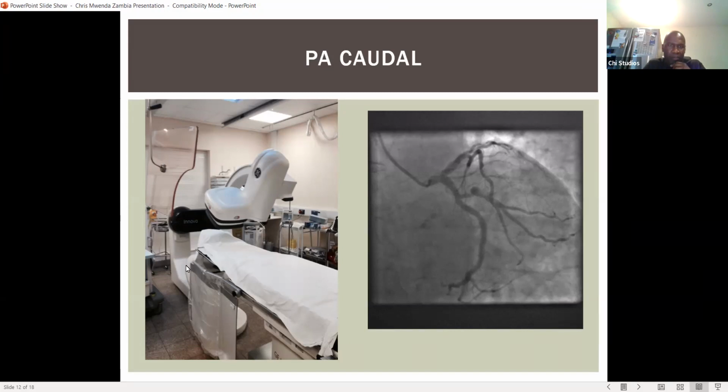Because this is a skirt, which was part of our radiation protection to protect the consultant. Usually the consultant stands here. So what happened is, sorry if I go out of subject, most of our consultants have got shiny legs. Why? Because most of them don't wear pads, because the X-ray is coming down here. And if they are not using it properly, they are being exposed to gamma, so they usually lose hair.